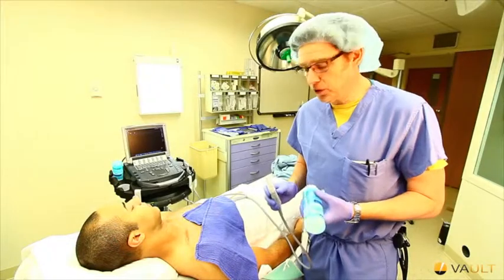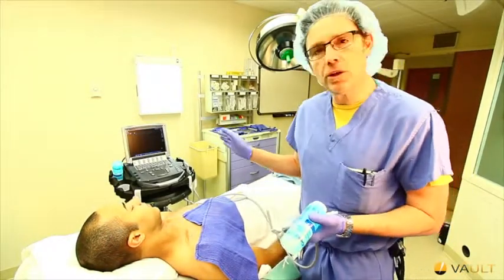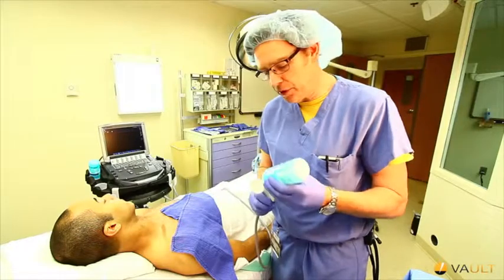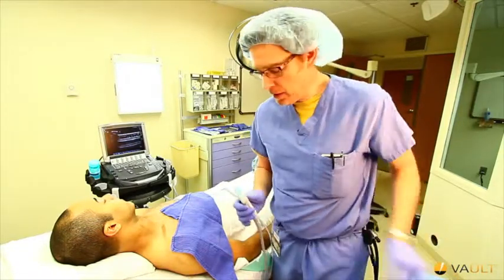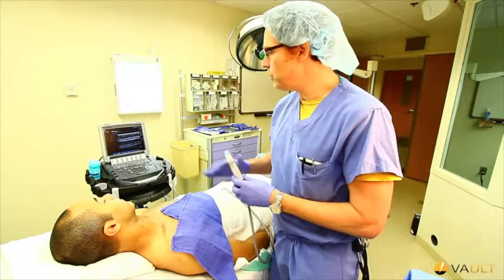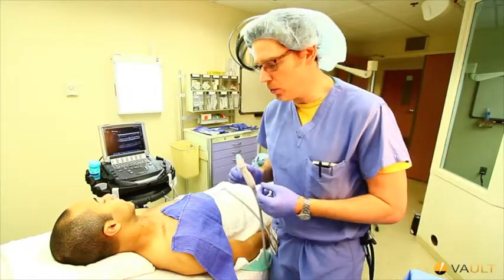Prior to starting any ultrasound image, we want to make sure that the patient is in a good position, in line with the ultrasound system, which will allow us to perform the procedure easier with less strain on the body. We're also going to apply sufficient gel to the transducer to make sure that the sound transmission is good. And we're going to make sure that the transducer is oriented to the image. We're going to make sure that the orientation icon is to our left, which lines up to the orientation icon on the screen, which is also in the left upper hand corner.